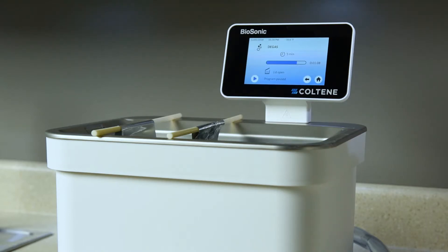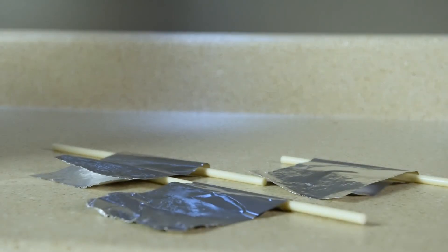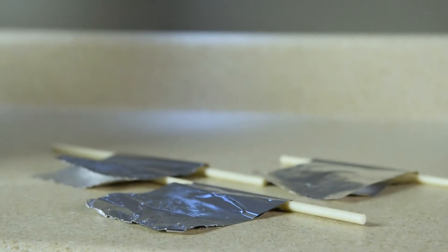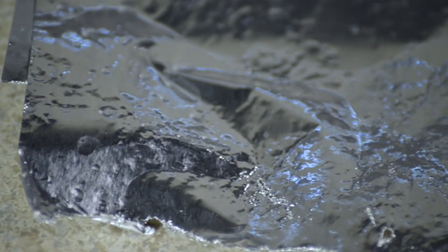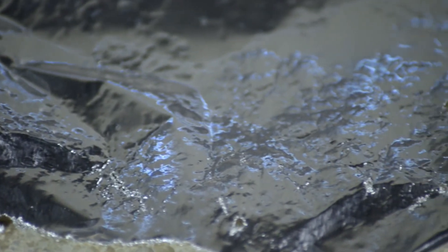Your ultrasonic cleaner is working properly when it leaves a pitted or wrinkled pattern in the foil. Holes should be observed in one or more of the foil pieces. This is an indication of a good quality test performed by your UC150.